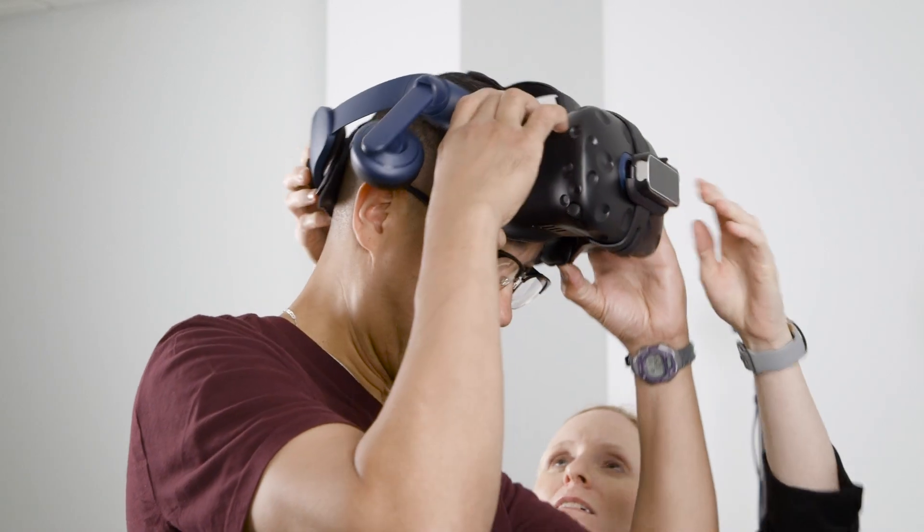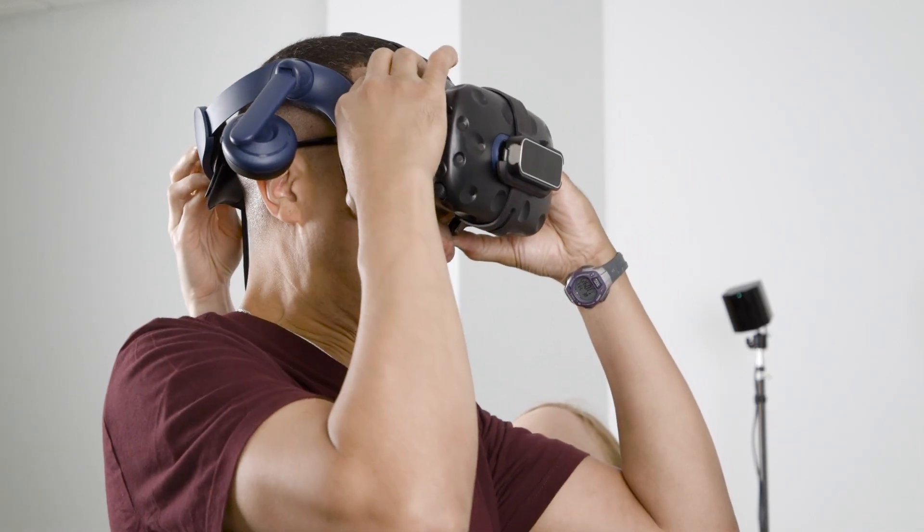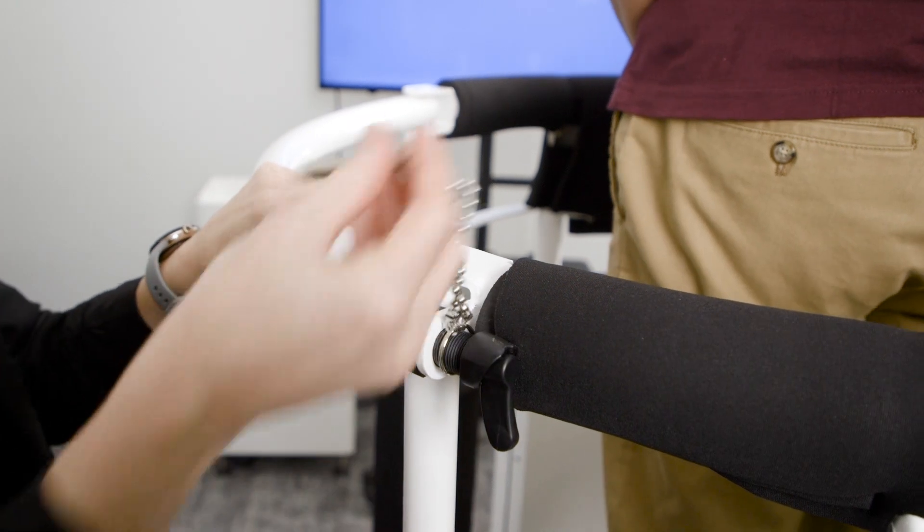When the feet are positioned correctly, assist the patient in putting on the headset. Then close and lock the safety ring.